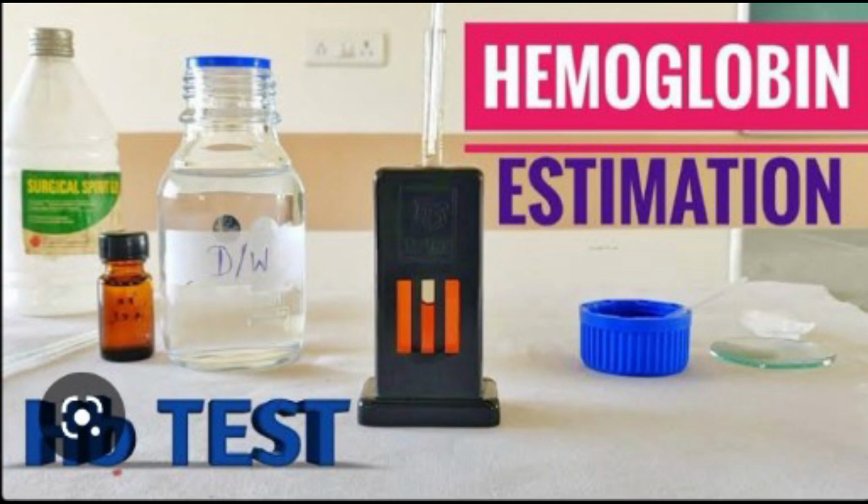Procedure: take 2 test tubes and label them as blank and test solution. Add 5 ml of Drabkin's solution in each test tube. Avoid mouth pipetting as Drabkin's solution is poisonous. Stopper the tube with a rubber cap. Add 0.02 ml of blood sample into the tube marked T. The sample is measured with the help of a Sahli pipette. Wipe off the tip of the pipette before adding blood into the test tube.